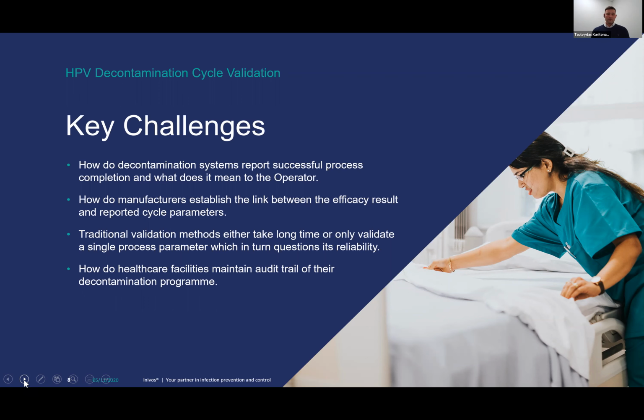And finally, how do healthcare facilities maintain their audit trail of their decontamination program? If we're using different ways of validating cycle effectiveness, how do we collect all of that information in a single place to make sure we can look back on it?